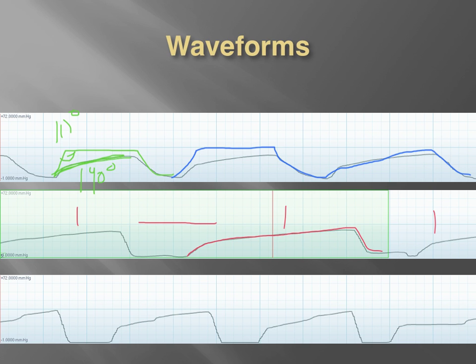So for me, I know we have a respiratory rate that's increased, which should decrease CO2 all in itself. Okay. However, we also have that delayed exhalation, right? Delayed exhalation typically will hold back the amount of carbon dioxide that's being exhaled at one time.